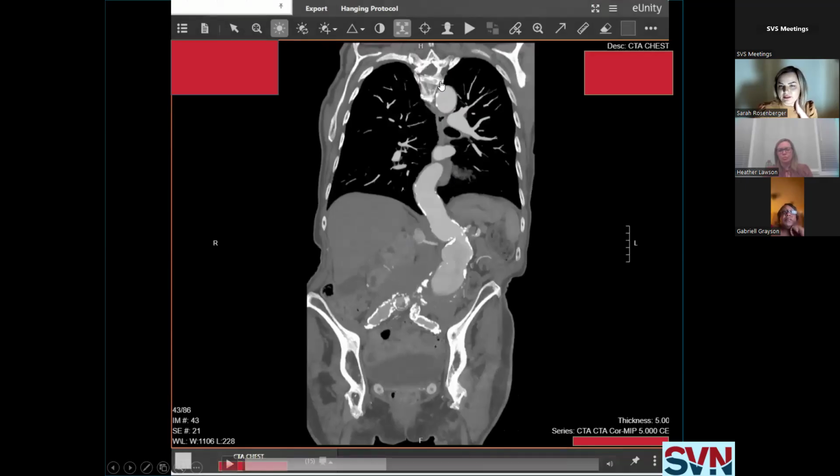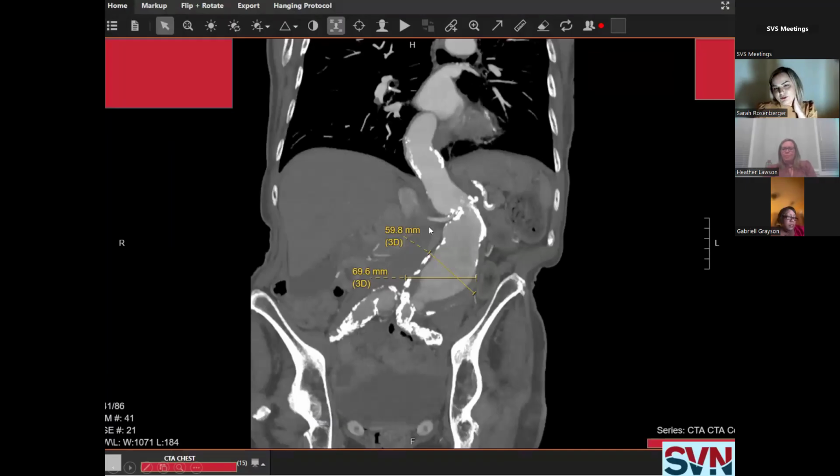All right, so you can see here the aorta takes an S turn as it comes through the body. And so the anterior, posterior, or completely horizontal measurements are not really a true reflection of that pipe's diameter, because the pipe is tilted. You get the next picture, which I think can show you here. So, the anterior posterior dimension on the previous image was 5.9. And here you can see that the lateral measurement of this aneurysm is also 5.9. The true horizontal axial plane maximum measurement is catching the aneurysm at an angle.